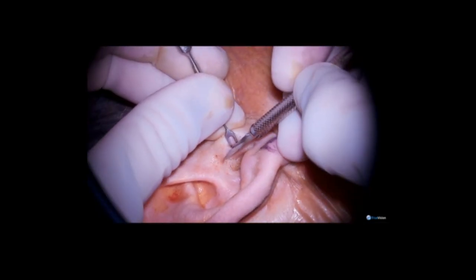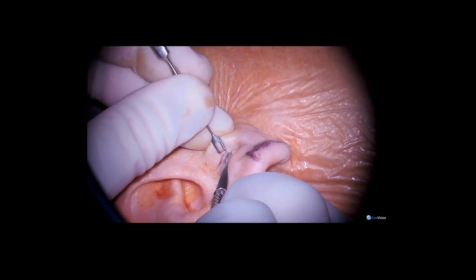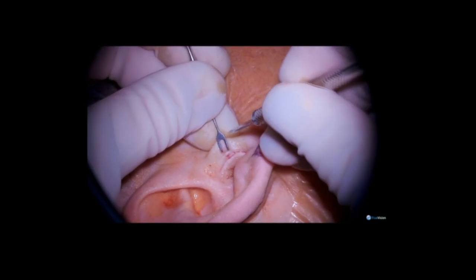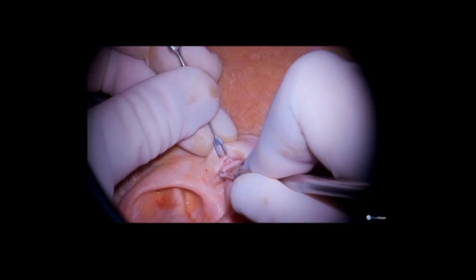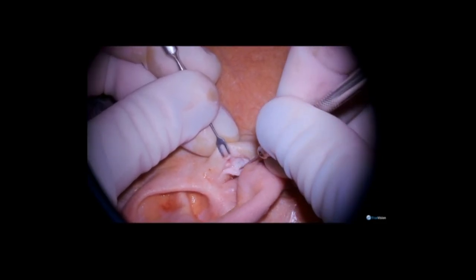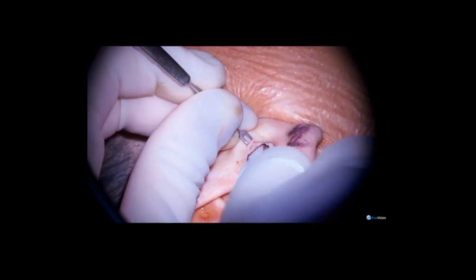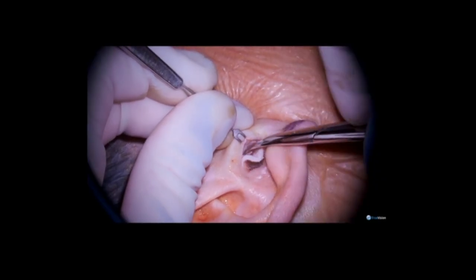Because in this case I anticipate that the attic bony defect is going to be fairly limited, I'm going to harvest tragal cartilage and perichondrium at the outset. The incision is hidden and the tragal tip is preserved to avoid the resultant cosmetic defect if not done so. The plane of dissection is between the skin and the tragal perichondrium. I am widely exposing this area in order to get the largest portion of tragal cartilage as possible.